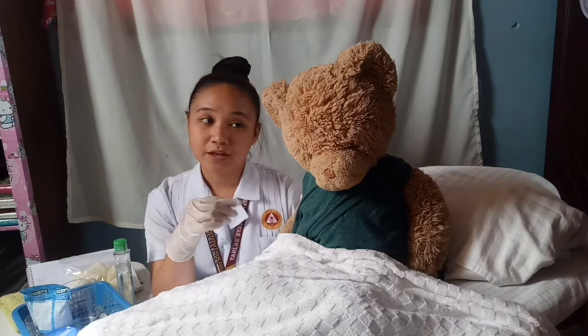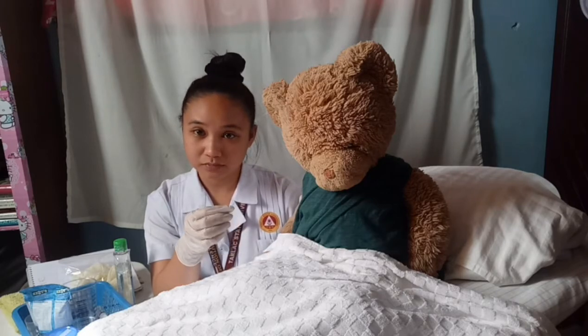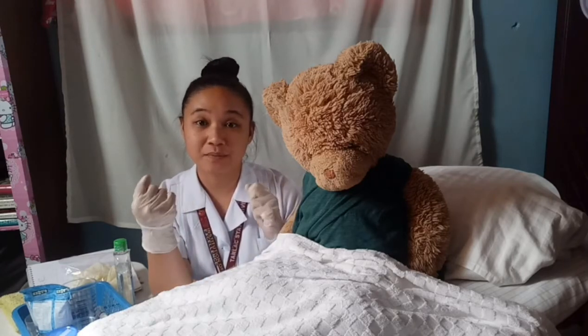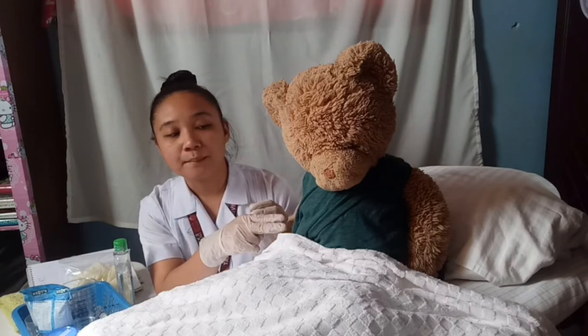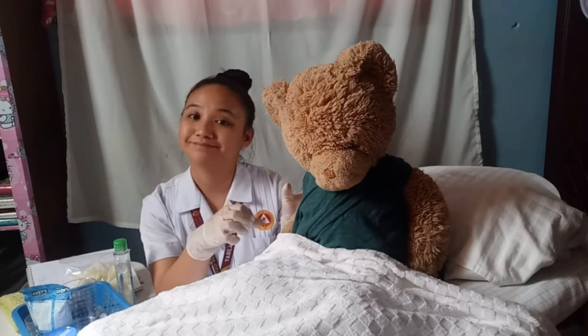And then if your patient has not yet had the required assessment, you need to take it. Let's say for instance I have my sphygmomanometer and also the stethoscope. So get the pulse rate, also the respiratory rate, and also the blood pressure.